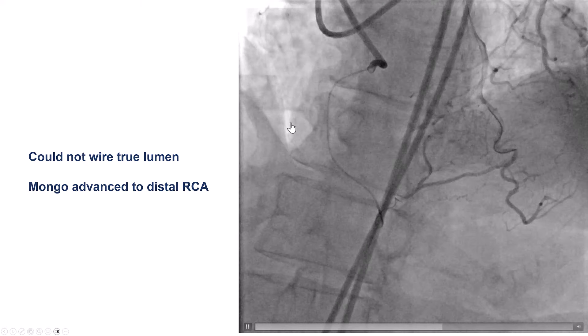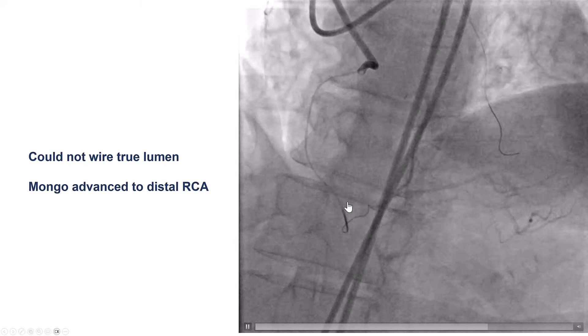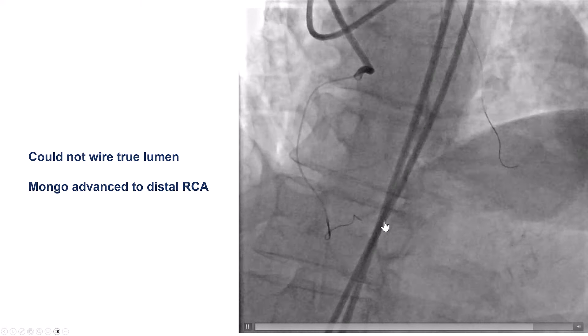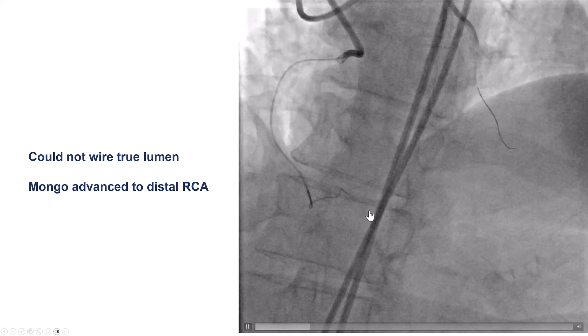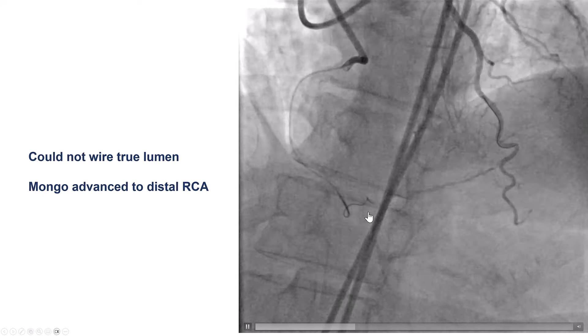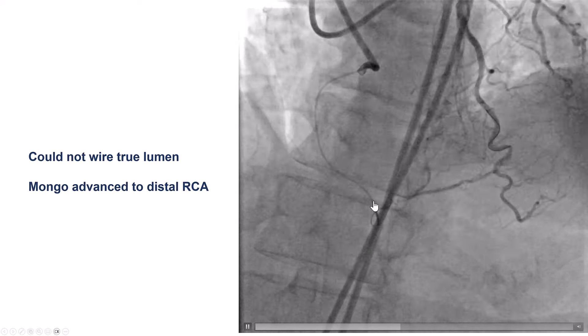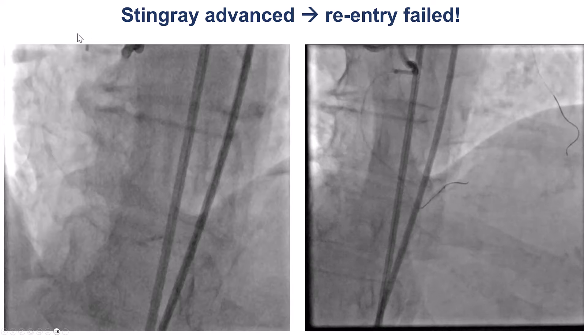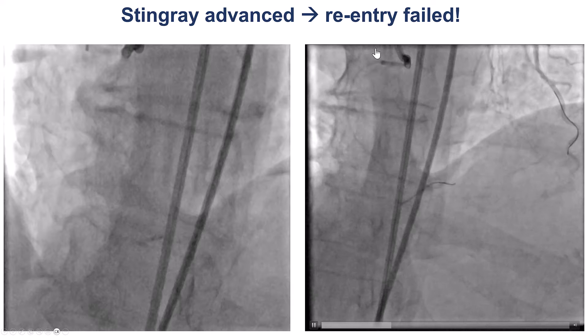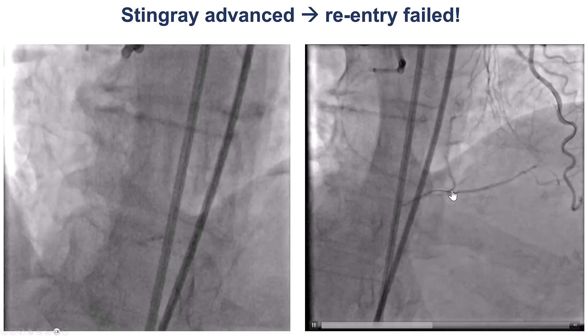In our case, we were unable to advance a wire in the true lumen. You can see here the wire is in the extra-luminal space. So, what we decided to do is try to perform re-entry.